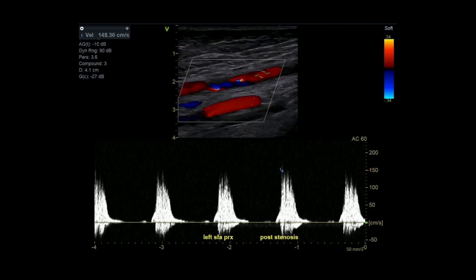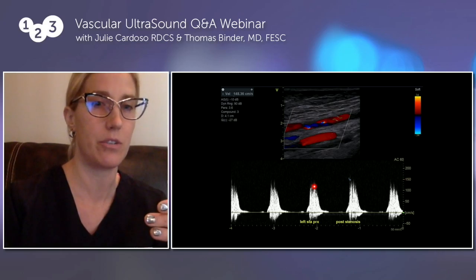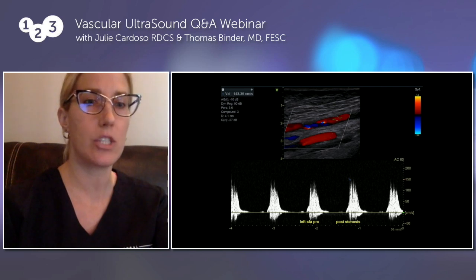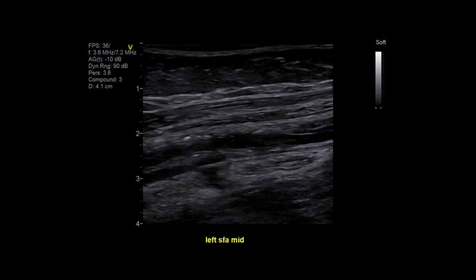Then when we're done, we want to evaluate the post-stenotic flow, because we want to see the effect of the hemodynamics of the stenosis on the waveform distal to where the stenosis is. So as you can see, it's monophasic and it's turbulent. And we also saw that with the color flow Doppler as well. So let's go ahead and go to the next clip.